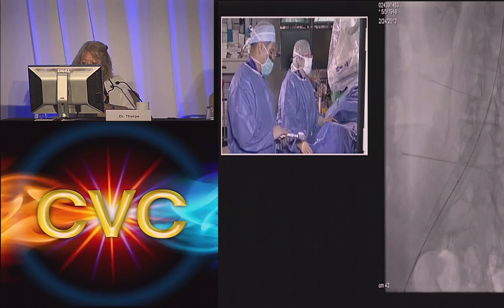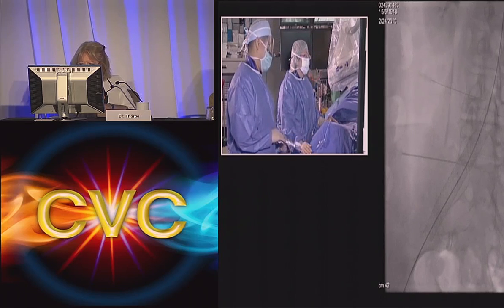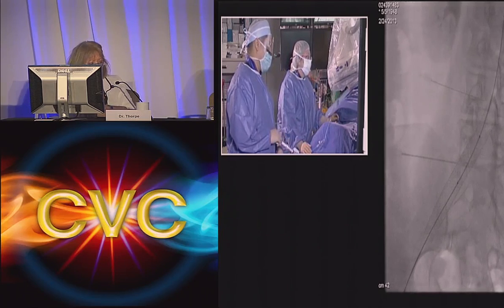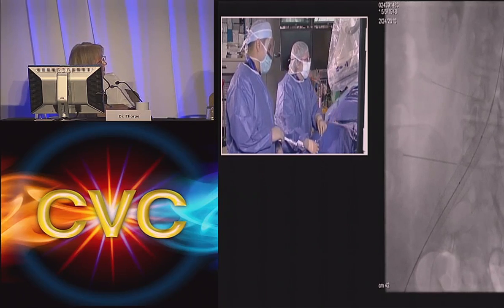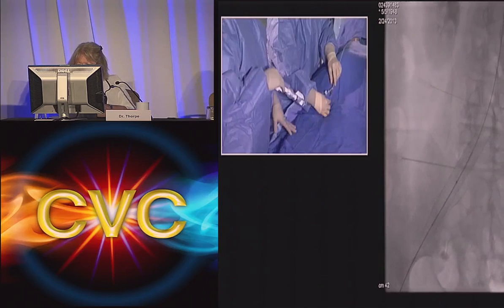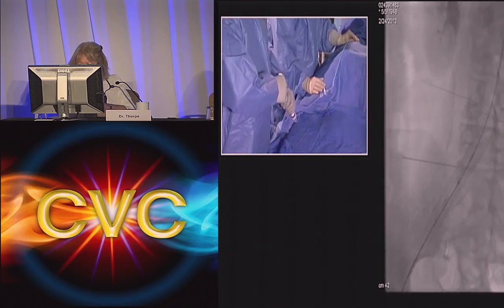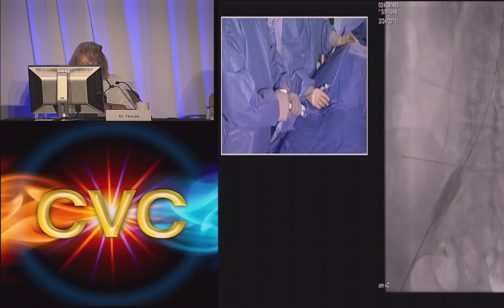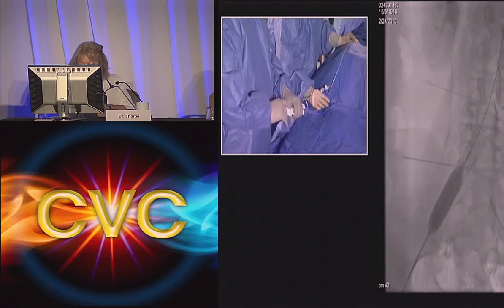You always want to extend that wall stent up just a little bit beyond where you want it to position, so when you dilate and it foreshortens slightly, you have that margin. And we'll come down here and go up one more time. See how I'm staying above the wall stent because of the chance of harming the balloon. Yeah, just a little bit. Okay, that's enough. Come down.